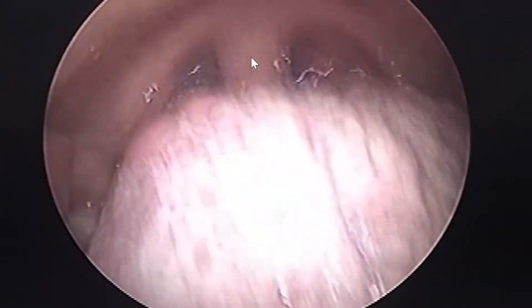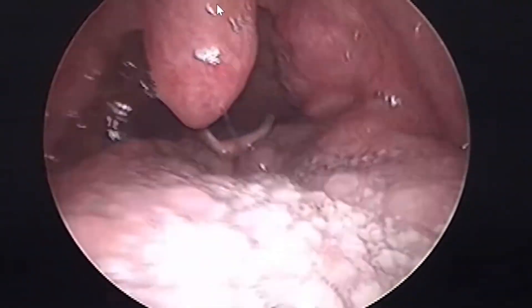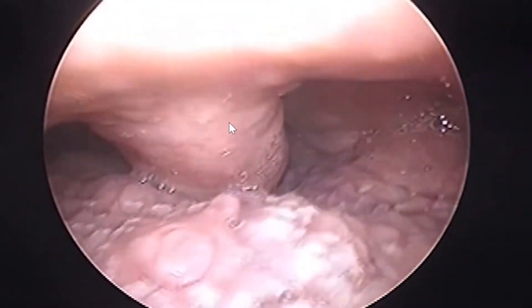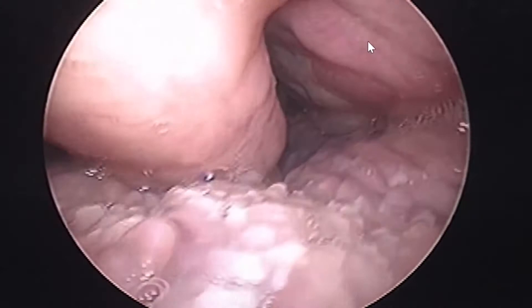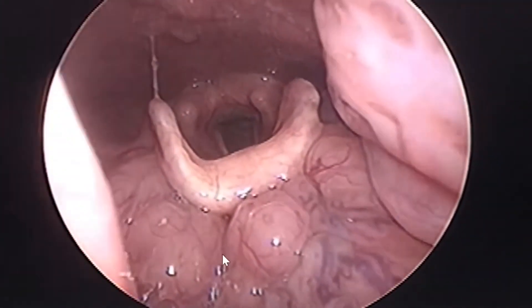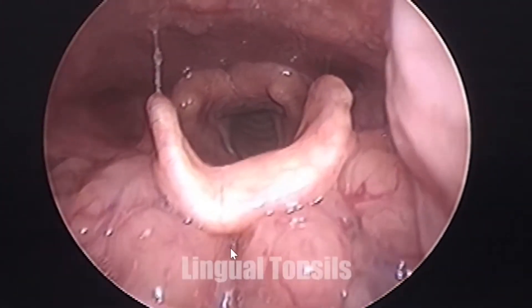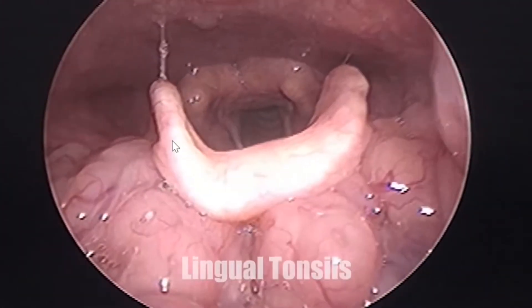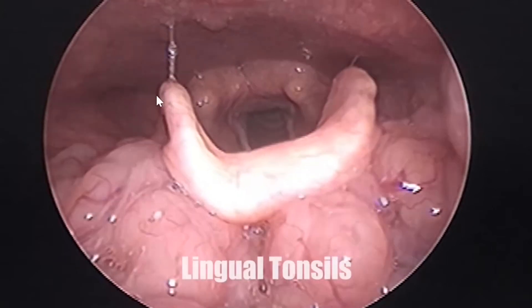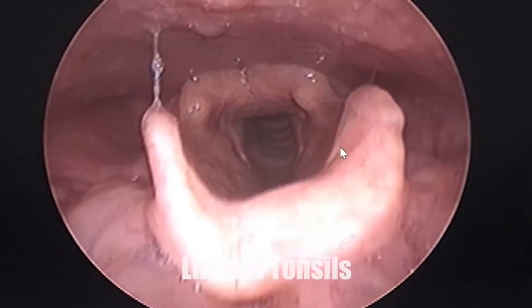First, starting with the tongue itself — see the coating of the tongue. The uvula is the hanging structure, and on both sides you can see the tonsils. Please note the prominent lymphoid follicles over the base of the tongue, which are known as the lingual tonsils.